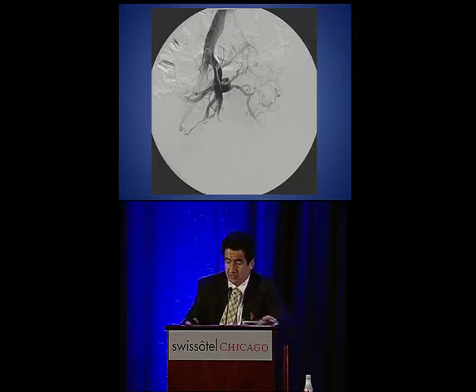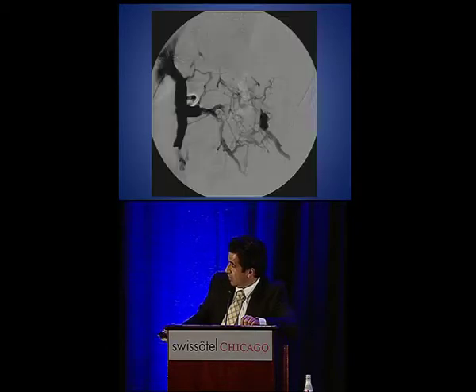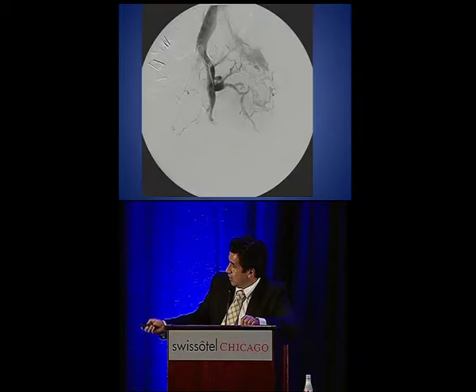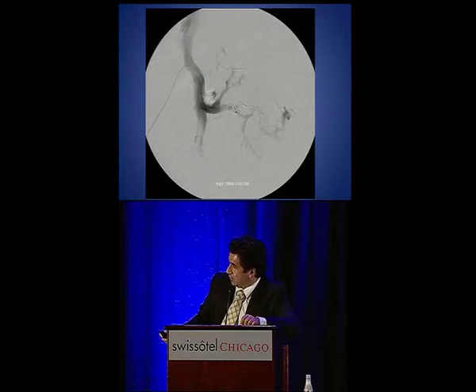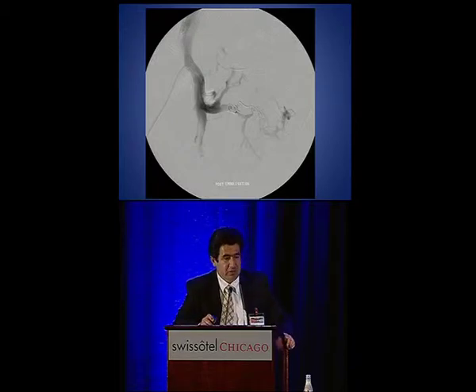You can see the lapse in the operative field, and he cannulated the hypogastric vein and found the area of bleeding, and then selected one of those branches of the internal iliac vein, coil embolized them, and masterfully controlled bleeding that otherwise is really difficult to achieve in surgery. You're working really deep in the pelvis, and that's not fun to do.